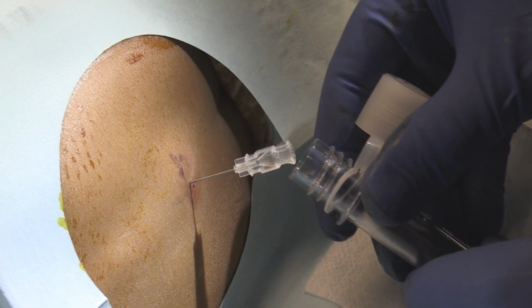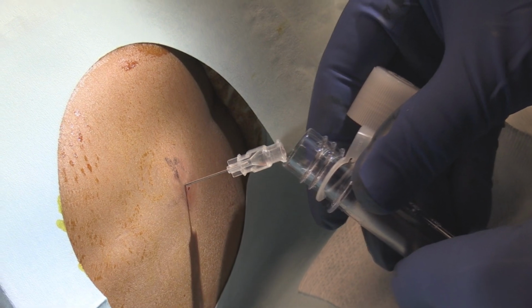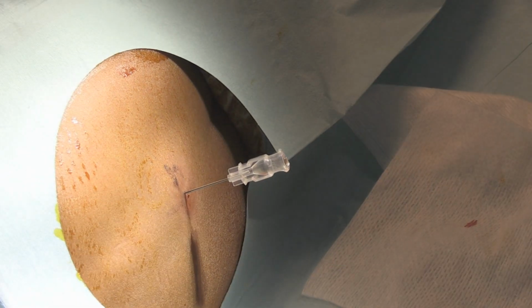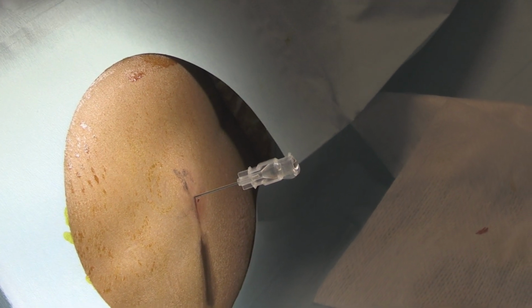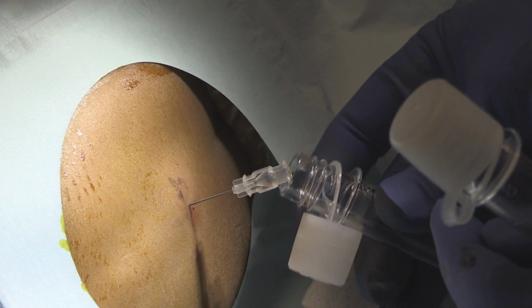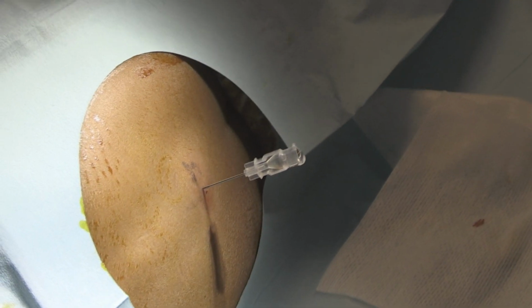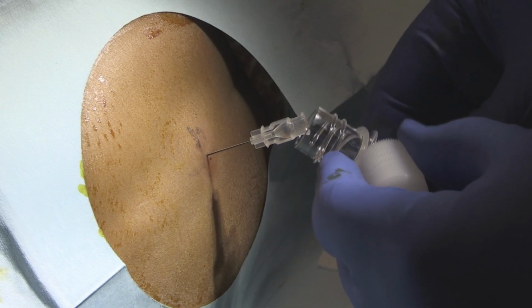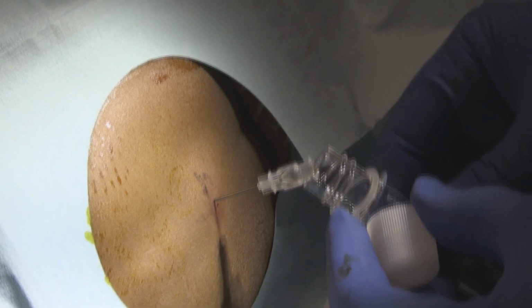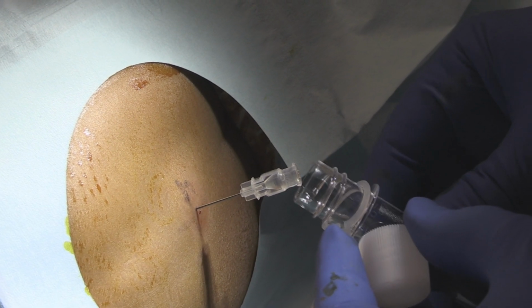But what percentage of time on the little ones do people not numb them up? Well, I've been here 17 years, and I'd say 90% of the time, there's no numbing. Why wouldn't you though? I mean, it can't hurt. The issue of not using anesthesia is probably more complicated than I understand. But the sense is that they don't feel it, and it's quick.